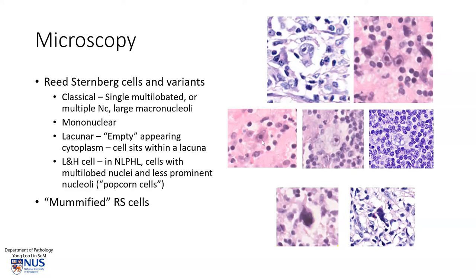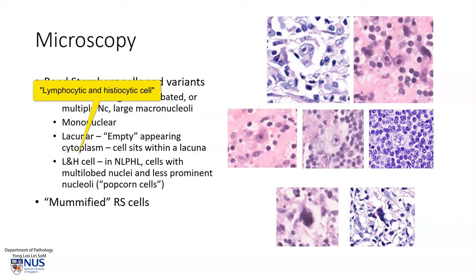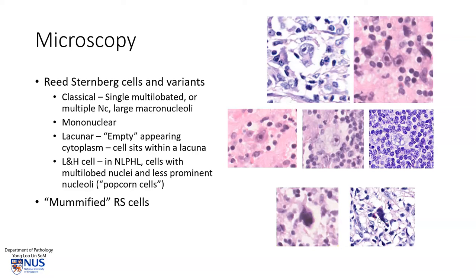We also have a mononuclear variant where there is only one nucleus with a prominent macronucleolus, and a lacuna cell variant where the cell with the large nucleus and nucleolus is actually sitting almost in an empty space. We have the non-classical Hodgkin lymphoma or nodular lymphocyte predominance Hodgkin lymphoma showing the L and H cell, which stands for lymphocytic and histiocytic cell. These cells are sometimes called popcorn cells because they don't have such prominent nucleoli, but their nuclei may be multi-lobed. It is also quite common to see these very degenerate, mummified cells, or mummified Reed-Sternberg cells, which look somewhat shrunken with a smudgy dark nucleus.